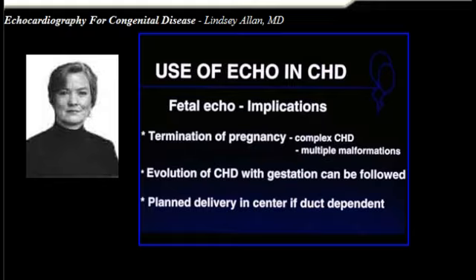The other thing that we can look at as pregnancy evolves is that we can see changes in congenital heart disease as the pregnancy evolves, and that can be very interesting in terms of understanding the evolution of congenital heart disease and perhaps thinking of ways that you could change this evolution in prenatal life.